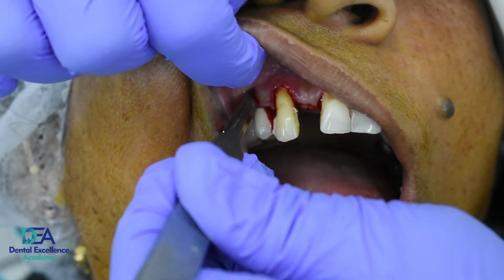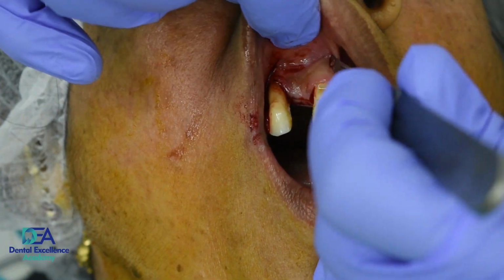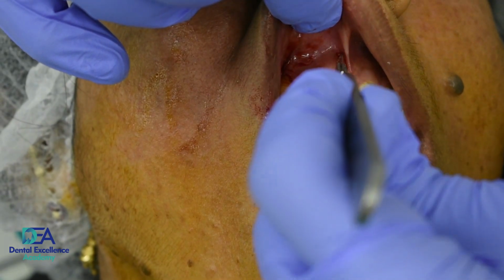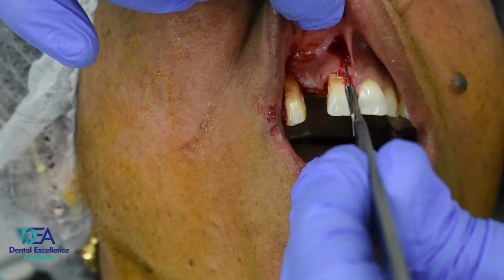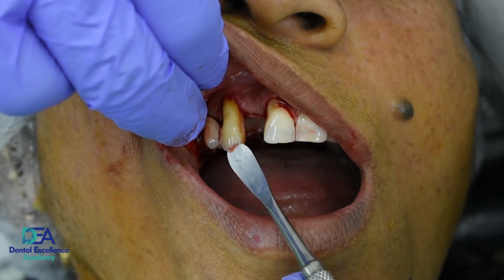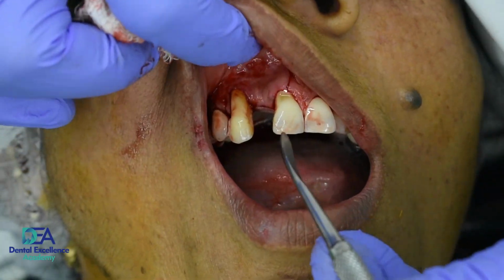I'm giving a vertical incision in this case so that we can reflect the flap properly, because we have to place two implants, and after placing the implants we have to pull the flap so that we can cover the implants properly. So that's why I'm giving the vertical incision.